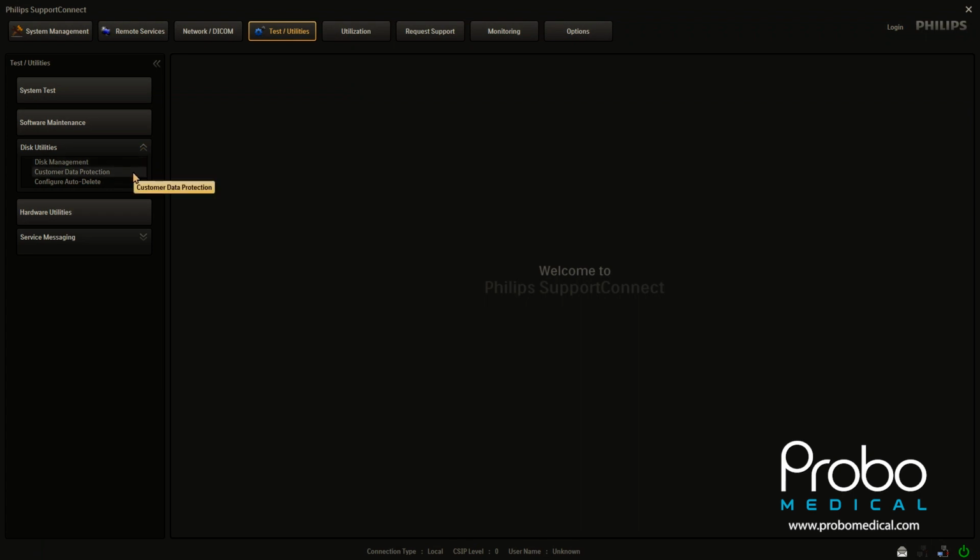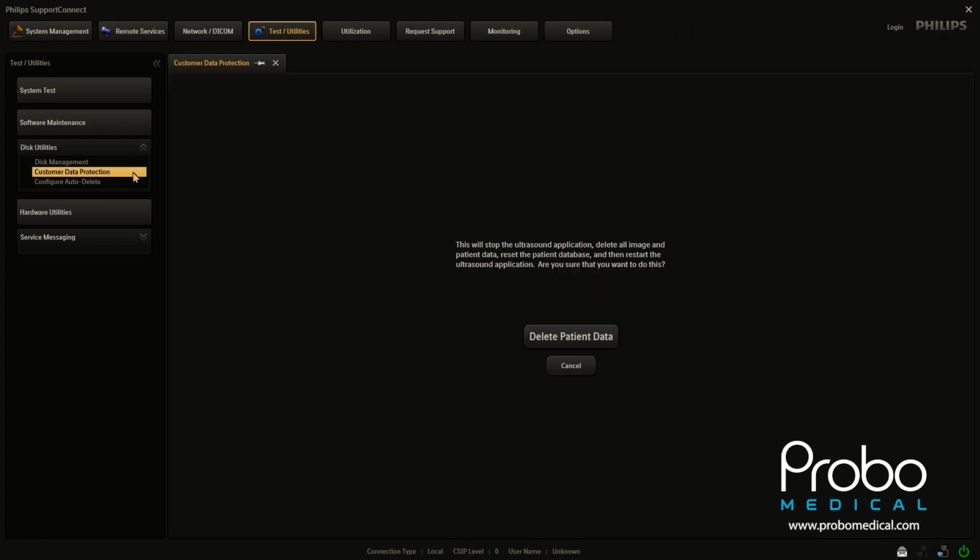Now, what you're gonna see, you're not going to see patient database utility or something like that. You're gonna see the words customer data protection. And that's what Philips has chosen to name this utility that does this reset. You're gonna select that. Then you'll see in the middle of the screen, you get the big giant button that says delete patient data. And that's what you want to do. Go ahead and click delete patient data. Again, this is going to delete all your patients all at once. So be sure this is something that is appropriate to do at this time.